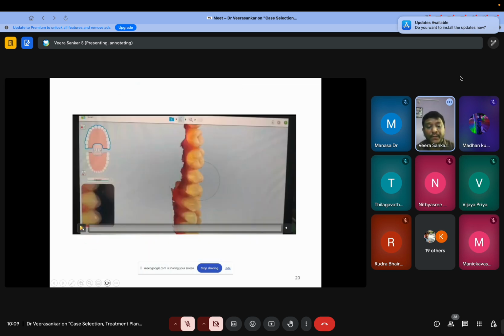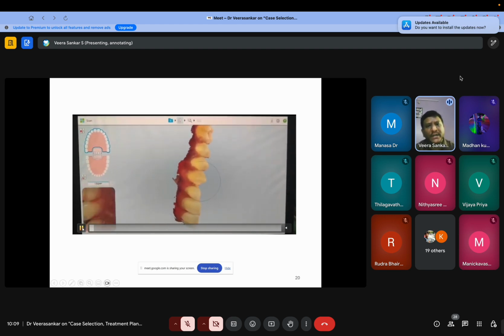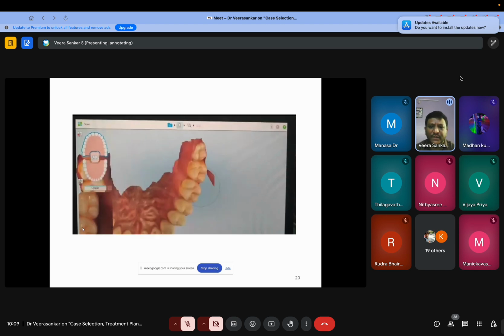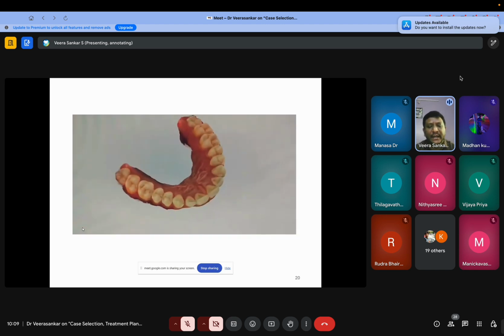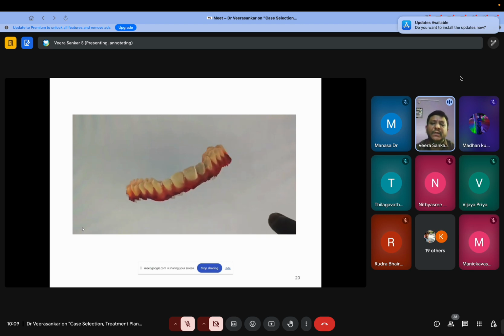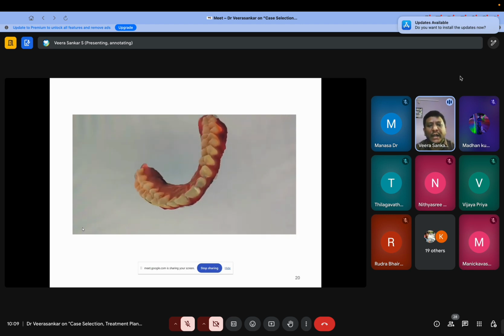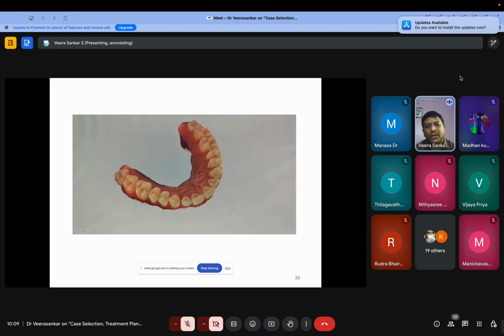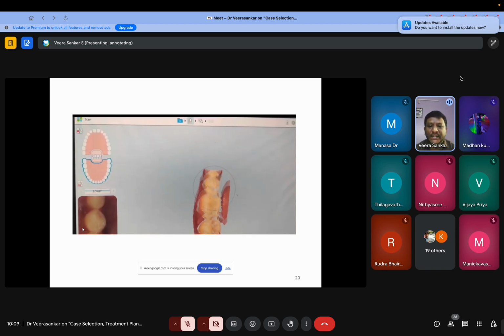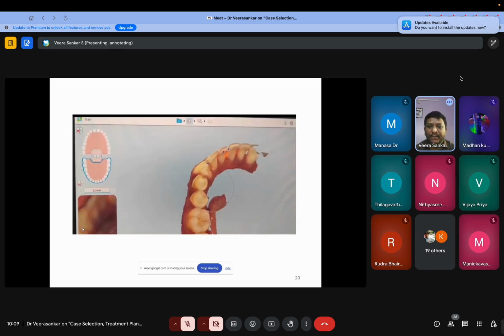So, any patient who walks into the clinic inquiring about clear aligners, the first step to proceed with is an intraoral scan. I request all our doctors to go ahead with the intraoral scan, whether the patient is willing or not, because only after the scan can we show the patients the entire position of their teeth in all 3 planes of space, so as to visualize what problems are there in them.